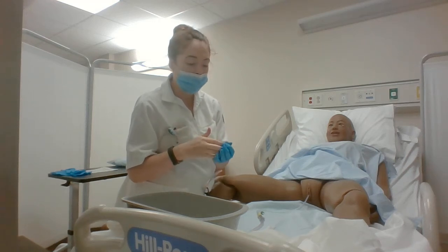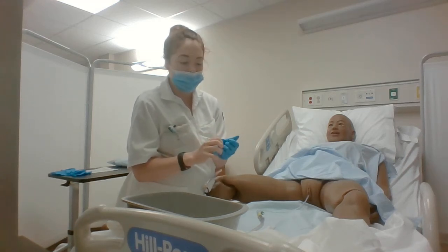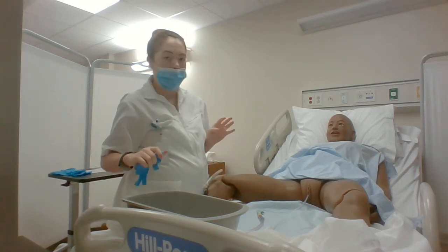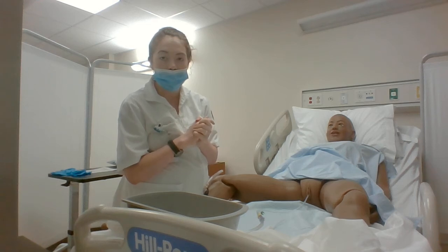And then I would document the procedure and the patient's response to the procedure, and then I would put on another pair of clean gloves.